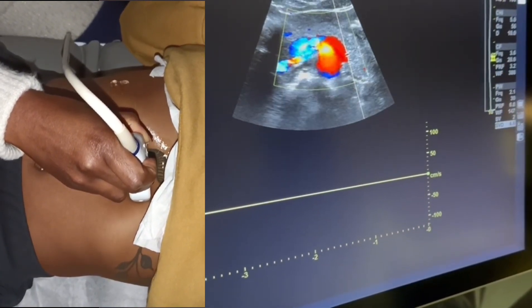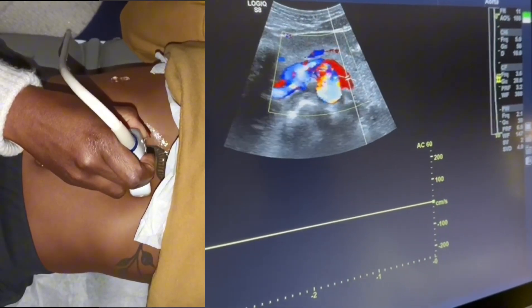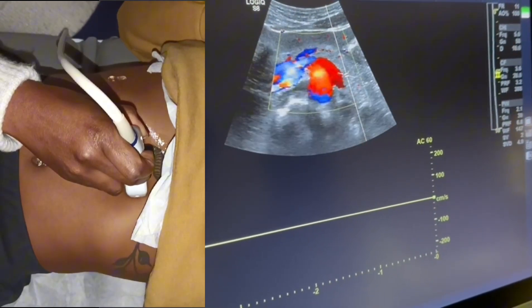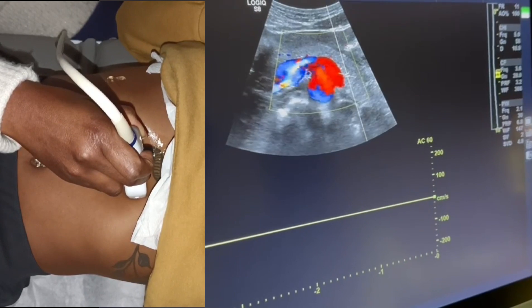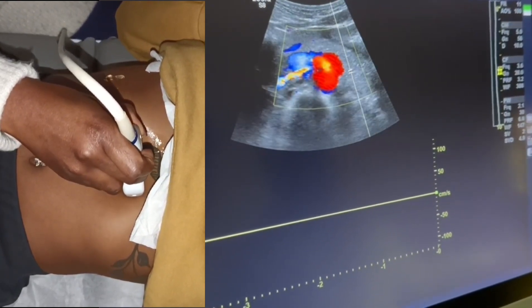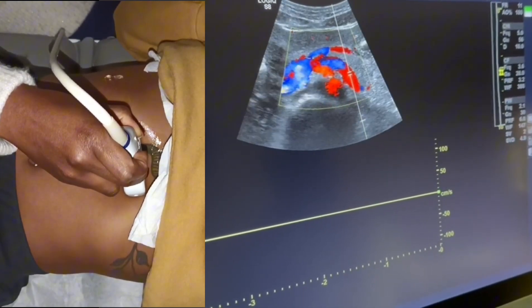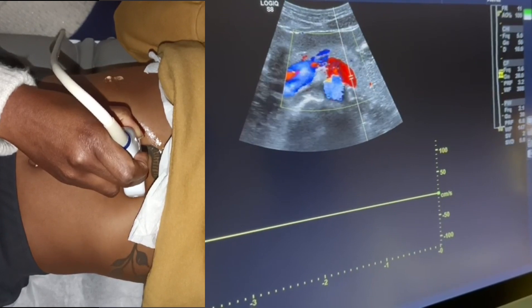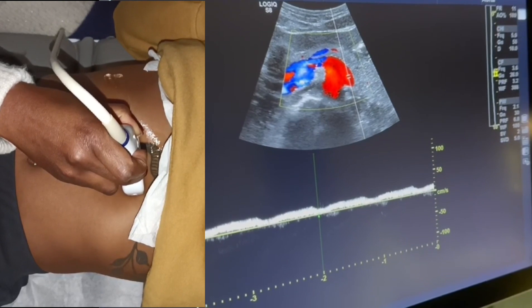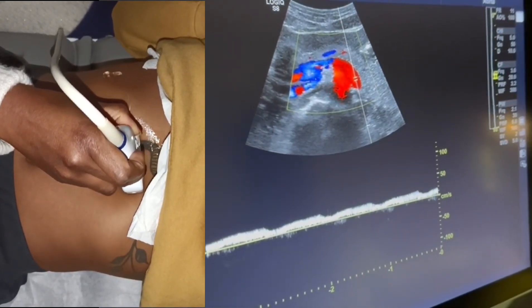I'm going to adjust my angle. You can use a zero degree angle if you like, but usually it's pretty good to use 60 degrees or less when doing abdominal Dopplers. I'm just going to take angle off to get a quick image. You can see the splenic vein flow is going towards the transducer — that reads normal.